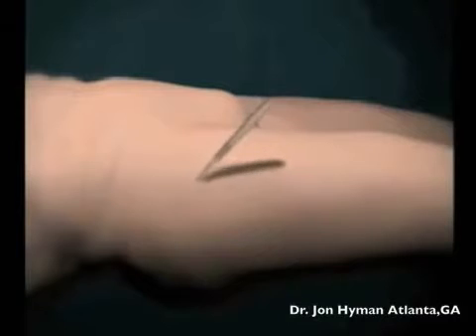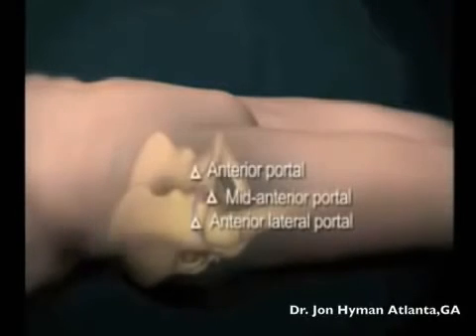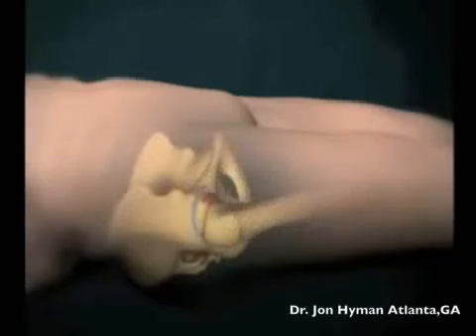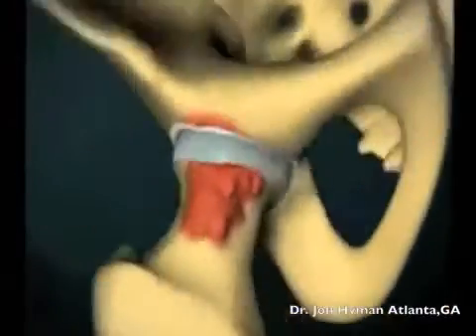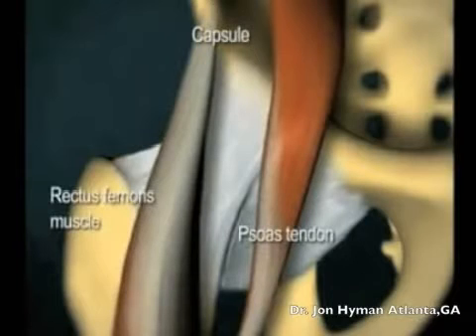Arthroscopic approaches to impingement surgery can typically be performed through 2 to 3 standard entry portals. There is a thick muscular and capsular envelope surrounding the hip joint. The 2 primary hip flexors, the rectus femoris and the psoas tendon, cross the hip joint and are subject to inflammation and tendinitis as a result of surgical intervention.